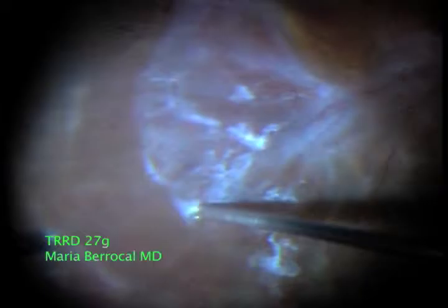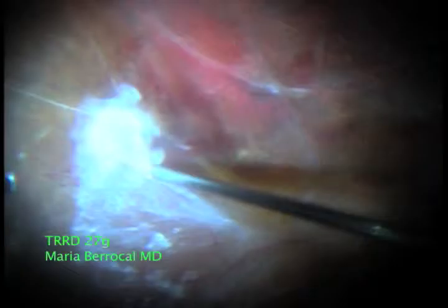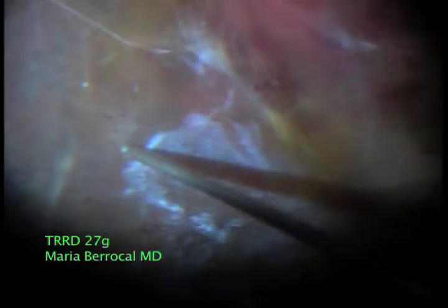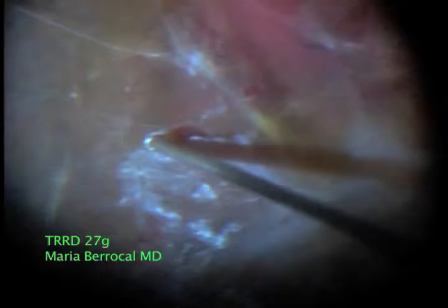These are cases that need to be treated very delicately because the retina is very thin and prone to breaks. The 27-gauge is ideal because it is very small, allowing us to shave all of this tissue from the surface of very thin ischemic retina in a very safe manner.